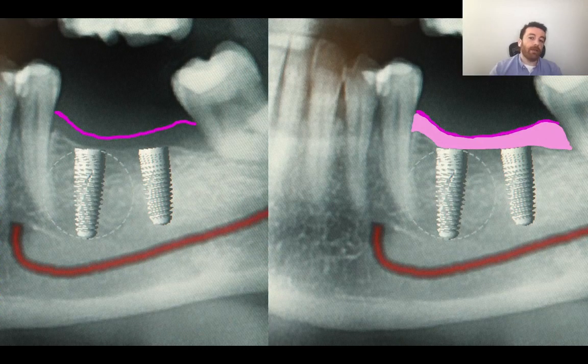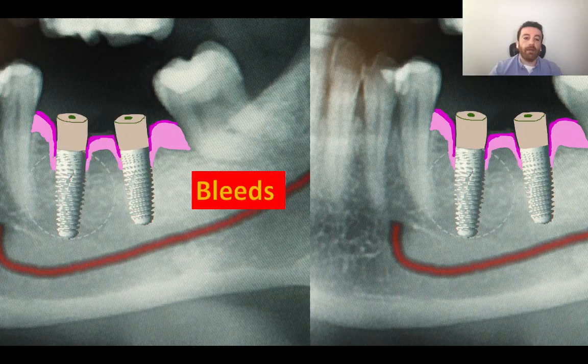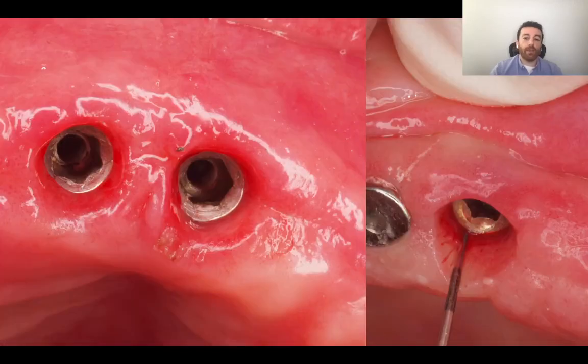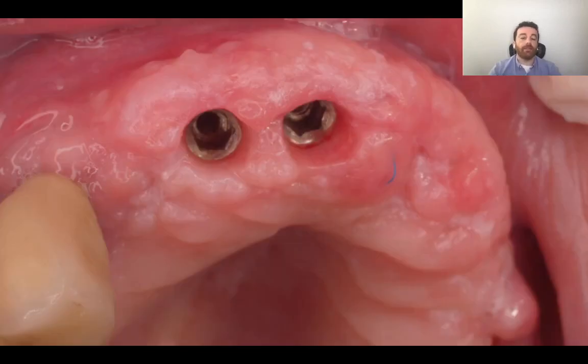So what does that mean in the long run for us? If you have your implant placed and you've connected your healing abutment, and now you've taken it off and you get some bleeding, which can usually occur on first disconnections of the abutments, and when you go back you notice some funneling or loss of bone around the implant, well, that's the potential start of a cascade that can lead to peri-implantitis. So we need to find a solution to this and how to prevent it. So we're going to discuss that next.